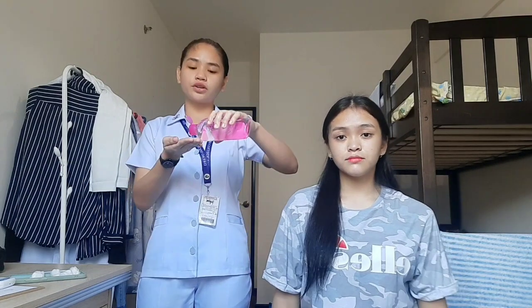After that, I will do my medical hand washing and I will don my gloves. This is to deter the spread of microorganisms. And next, I will provide the client privacy by closing the curtains or closing the door of her room and adjust the temperature of the room. Next, I will position the client in a sitting position to obtain her oral temperature.